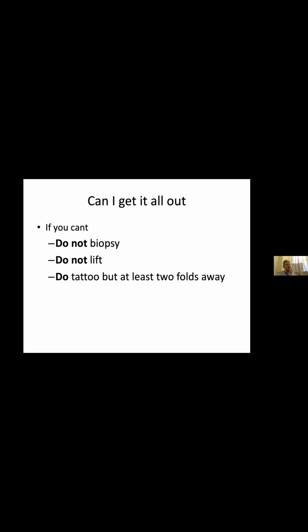Don't attempt to lift it if you can avoid it. Sometimes the reason why you've abandoned it is it doesn't lift, fair enough. But if you have lifted it, you create fibrosis. And once again, next time you come, your chance of being able to lift it is smaller. What you do need to do, unless it's somewhere like the cecum with obvious landmarks where you know exactly where you are, is tattoo it, but you need to tattoo it two folds away, because we don't want that tattoo to seep in under the polyp, because the carbon in the tattoo is an irritant and it causes fibrosis once again.